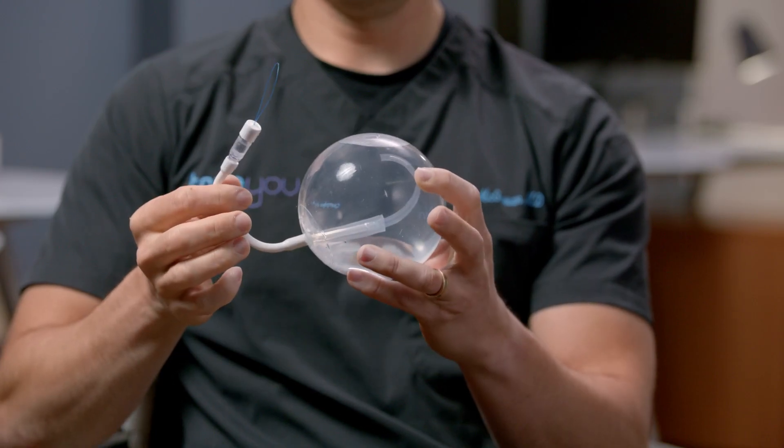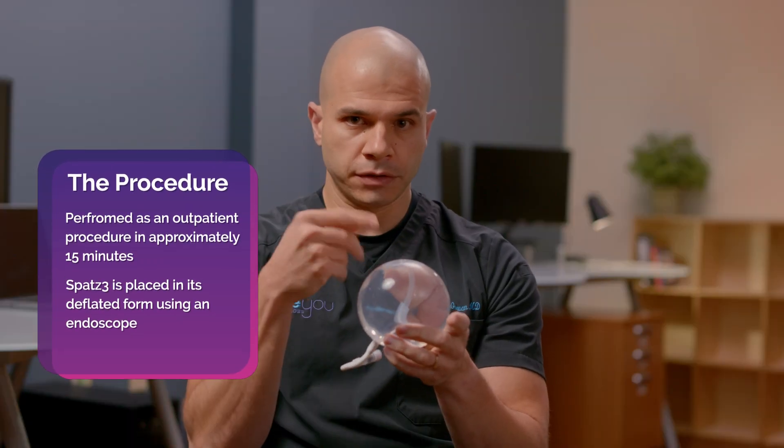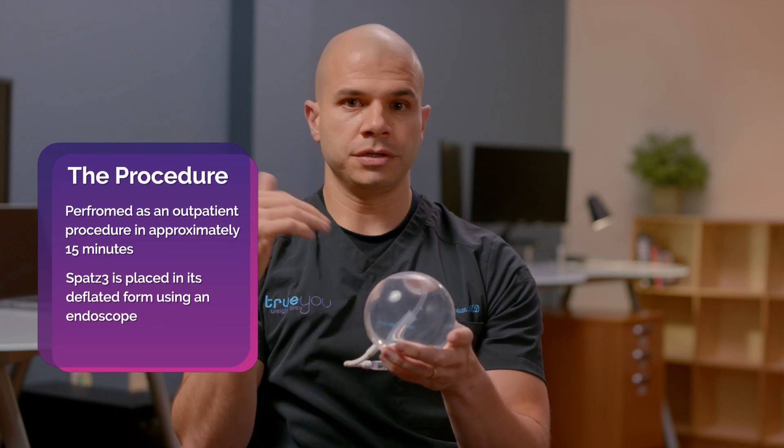This is the SPATS balloon. The balloon is a silicone clear balloon and it's filled with sterile saline. The way this is placed is it's actually deflated and wrapped up initially. We pass it into the stomach and then fill it while watching with our endoscope.